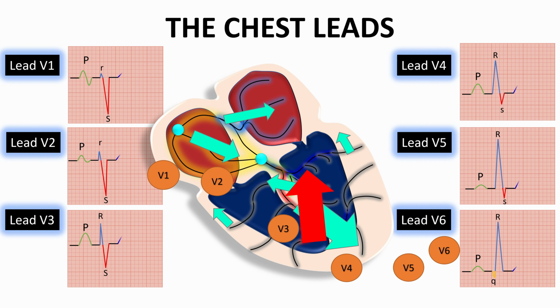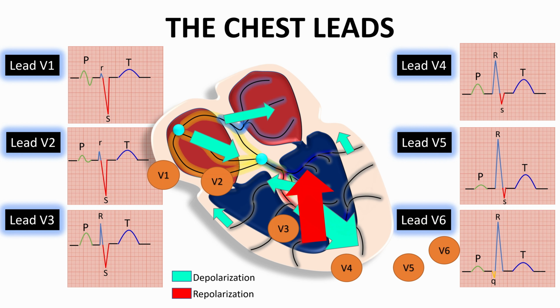And as the depolarization ends, the repolarization starts in a direction opposite to the depolarization, but as they carry a negative force, they will pick up a positive wave on most of the chest leads.